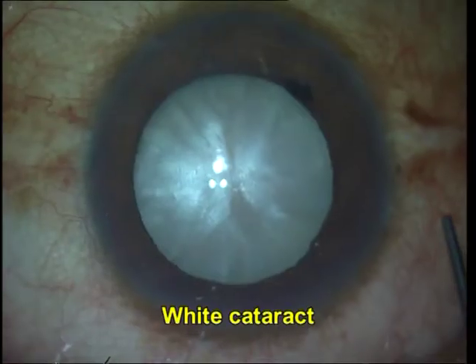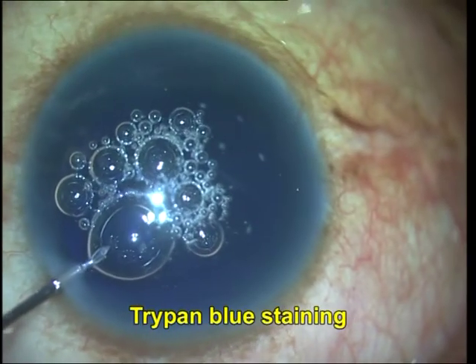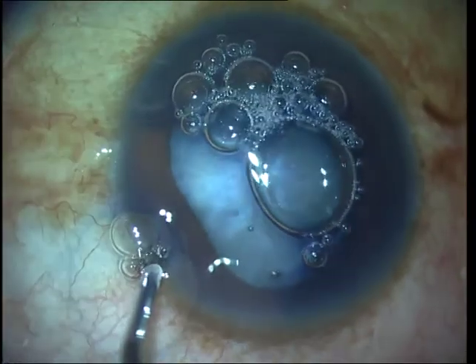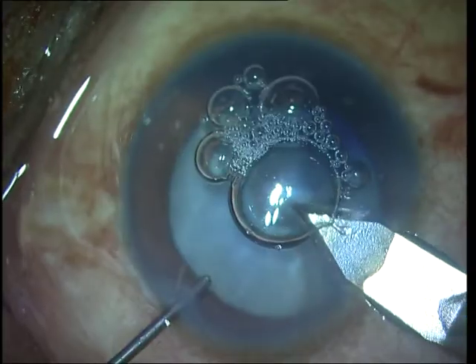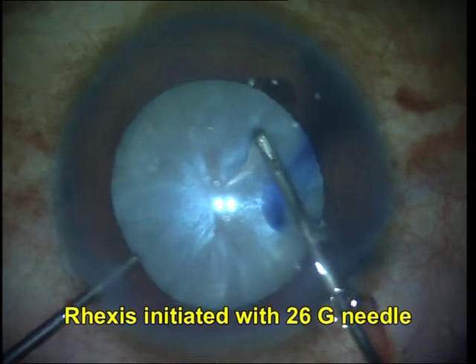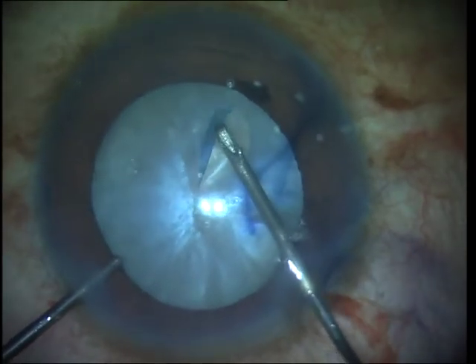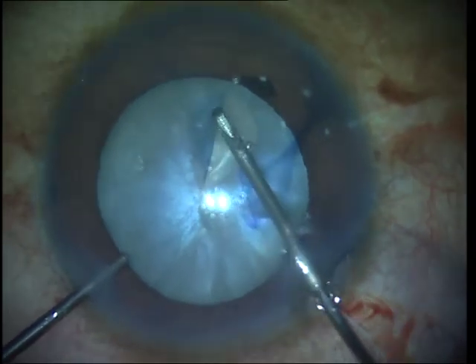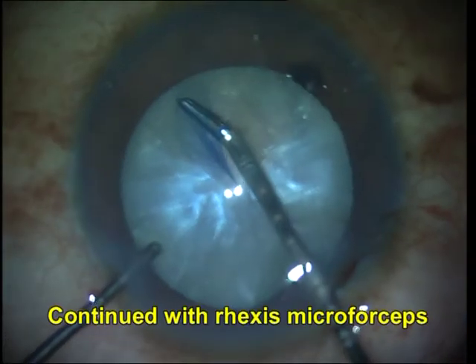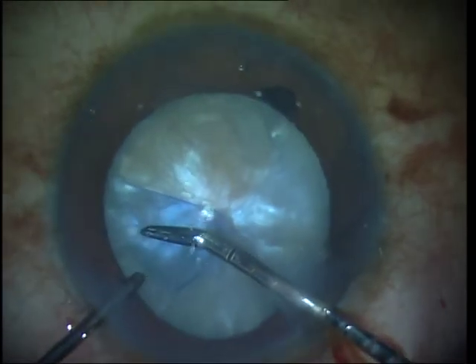This is another white cataract case where I am doing a vertical chop using a short sharp chopper - the Agarwal chopper - and I have no financial interest in this product. You can see that I am initiating the rhexis with a 26 gauge needle. There is no milky fluid here; however, the intralenticular pressure can still be raised, and therefore it is often wise to move to a rhexis micro forceps rather than try to continue with a cystitome.